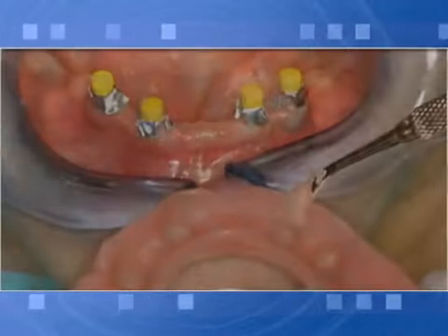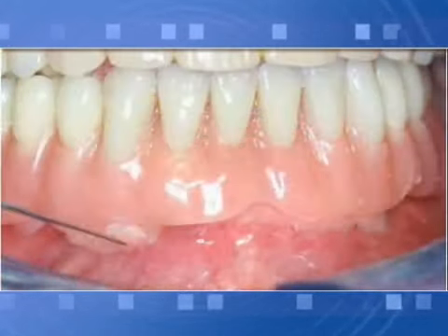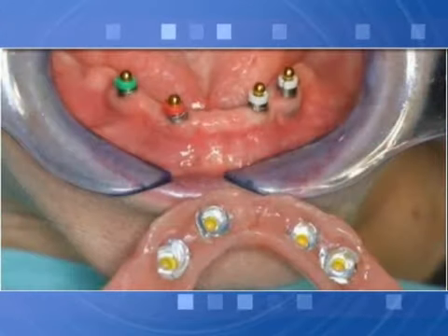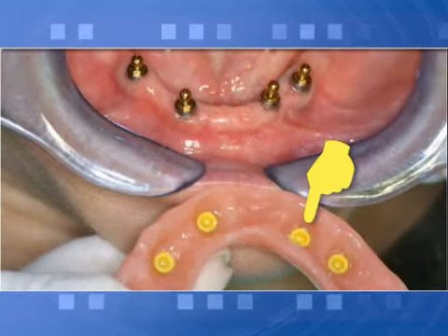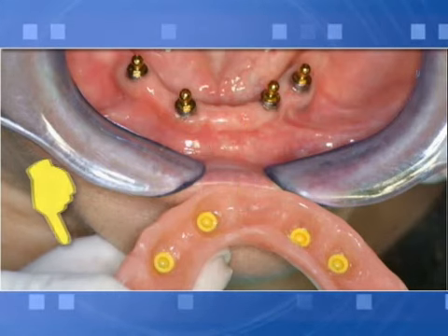Temporary denture, curing of retentive caps in the patient's mouth. During caps curing with resin, always use the protective disc to avoid risk of blockage by resin waste. A piece of plastic or disposable glove can also work well. Polish the denture to remove resin waste and deliver to patient. Be sure that any resin waste does not block attachment surfaces, as shown.